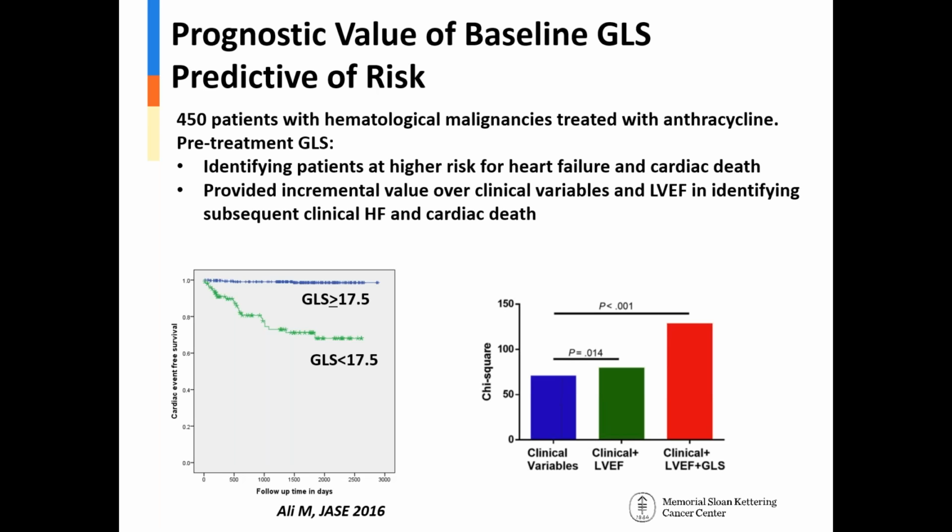There are things that we look for to see whether the underlying region of interest is tracking the myocardium, and determine whether in fact the GLS value is valid. Several of us put together a primer that goes through it step by step, and that's much needed, the education on how you recognize poor tracking, and the many pitfalls of strain imaging. It's not a black box, it requires education.